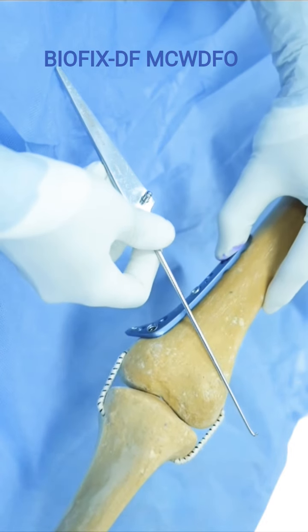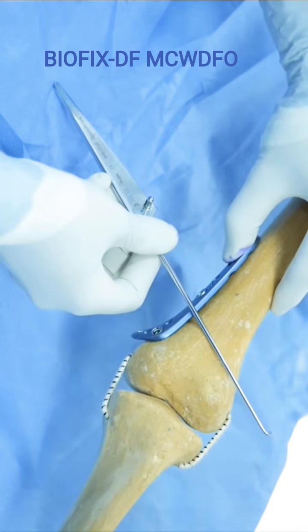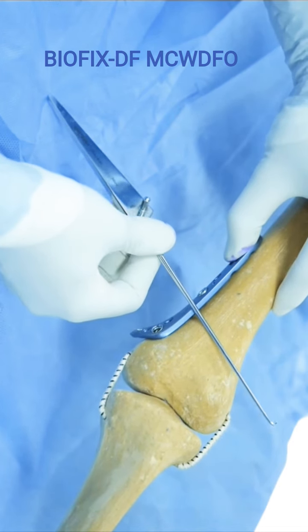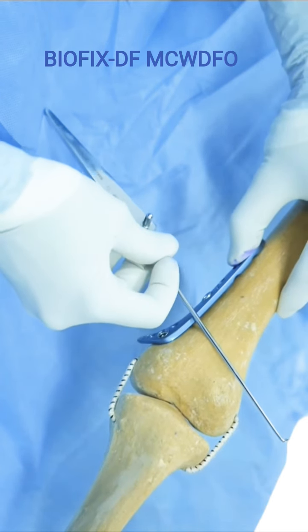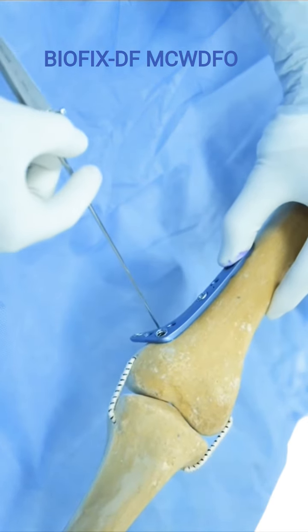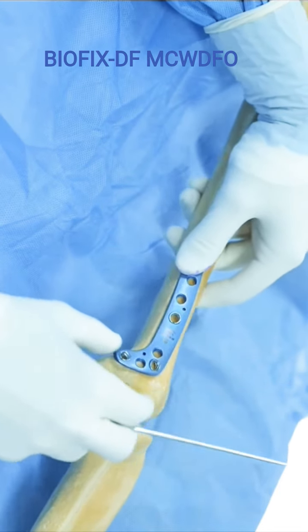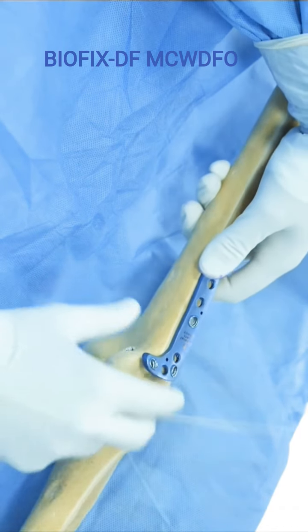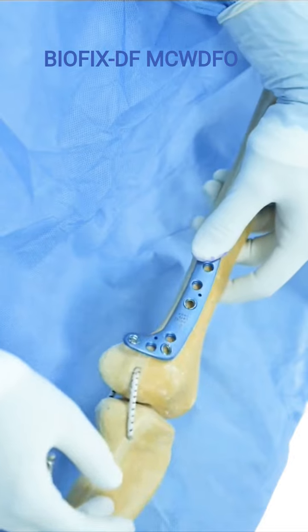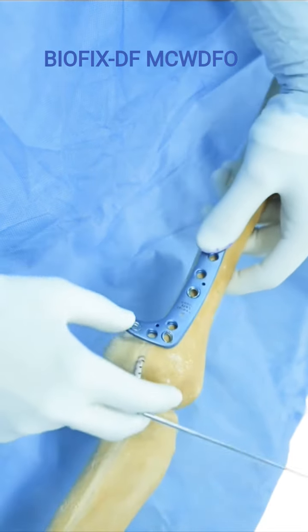So when we place the plate correctly in line with the osteotomy plane here, and the osteotomy plane again is important because if we see this angle which it forms with the plate, this is actually 90 degrees on both sides. This is 90 here and 90 here, correct. So when the plate is positioned as such, you see this will be slightly more anterior like this, and when adequately positioned, this sits almost perfectly with the anatomy of the patient. There might be some offset because of individual variations, but typically this completely sits flush to the distal femur.